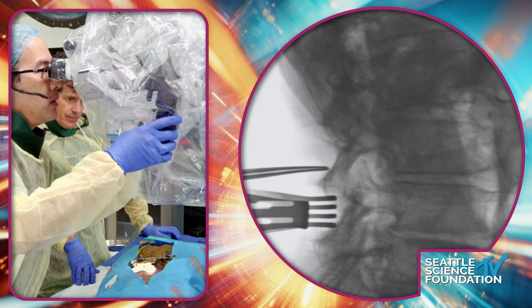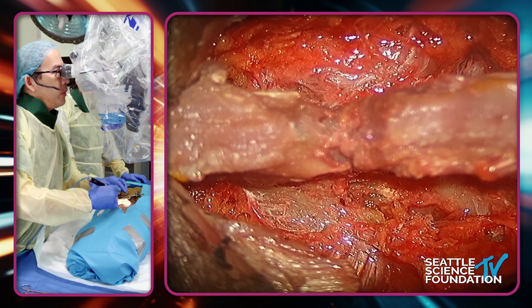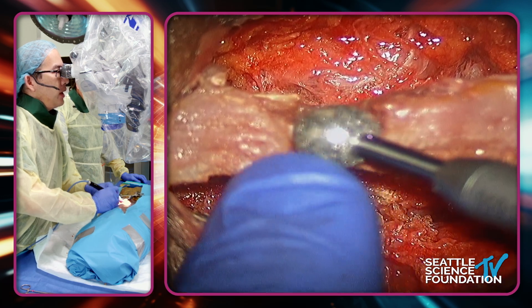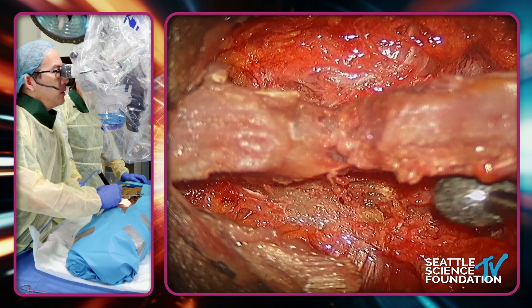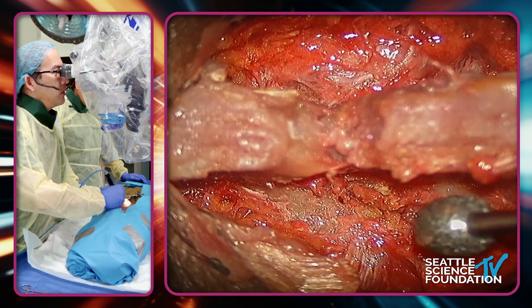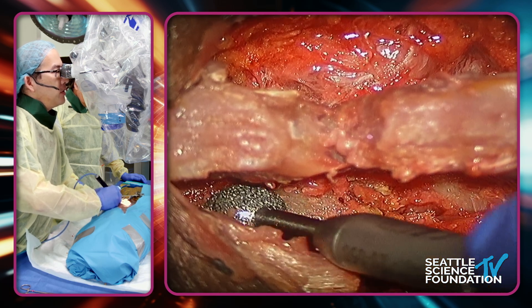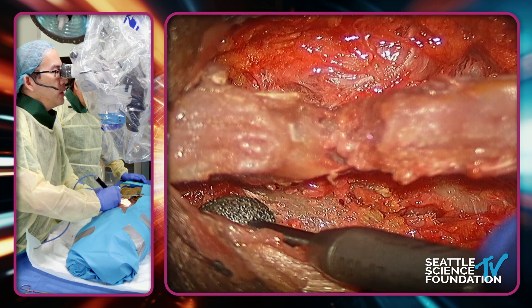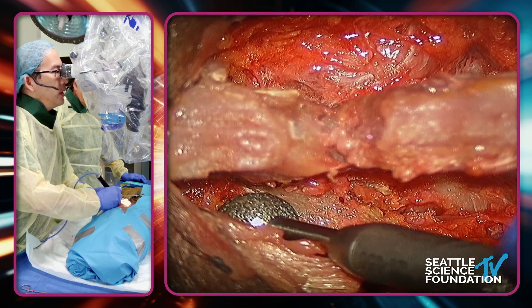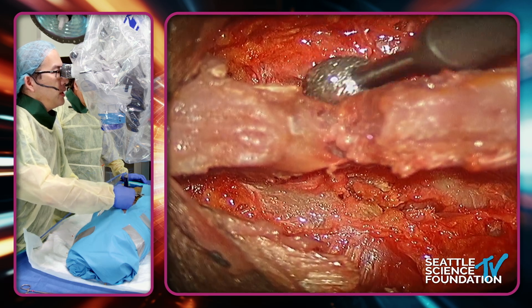Switch to the microscope view. We've exposed the rostral and caudal spinous processes and I use a six or eight millimeter drill bit. You see the lamina here rostrally, caudally — let's call this L2, L3. You see that the facet joint is very close together, so at L2-L3 you can't take too much otherwise you're going to destabilize the segment. So if you're looking for a unilateral decompression to decompress the disc, remember CoFlex is all about decompression. You'll preferentially take the laminectomy or hemilaminotomy up higher on the side where you need to get that decompressed.